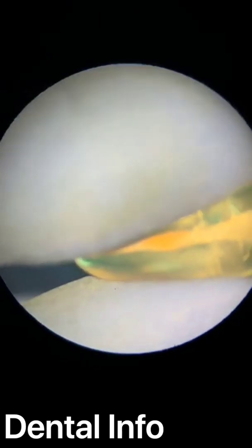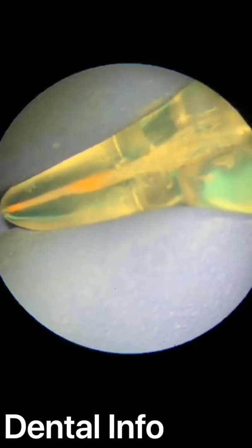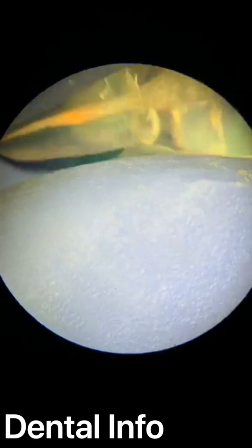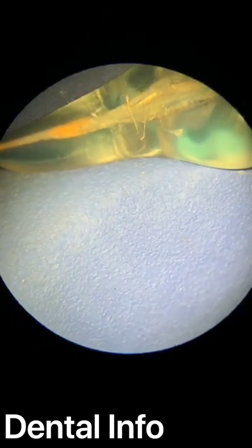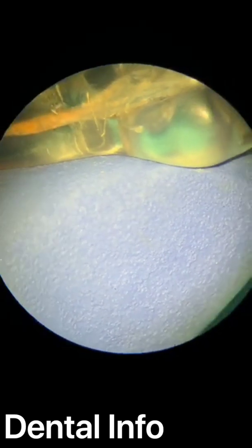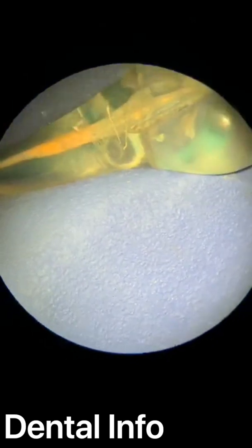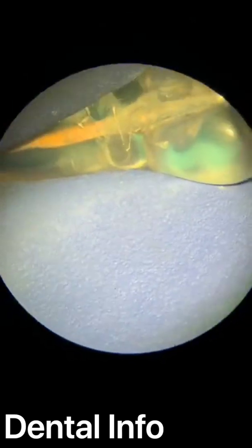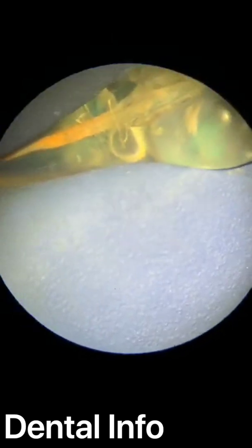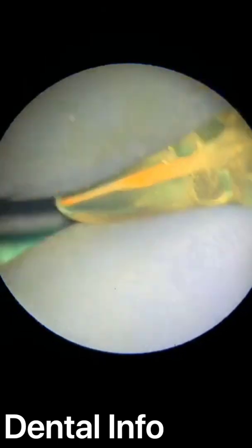In this case, you will not have pores or bubbles inside. You will have fewer bubbles. You will have a very nice obturated canal. So let's go. Enough. I will stop. I will go out. I will take my spreader and push the gutta percha inside. In this case, when you take an X-ray, you will have a very good dense gutta percha.